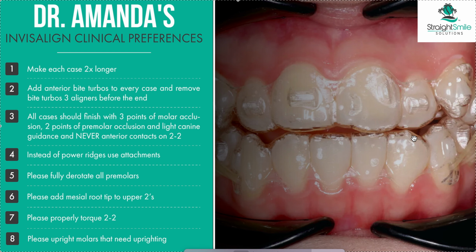And a lot of patients don't expect it. They don't understand that unless it is their second or third time around. They really think that once the Invisalign's done, that they're done, and that's it. And they get one set of retainers and they're good for a lifetime. That rarely happens.